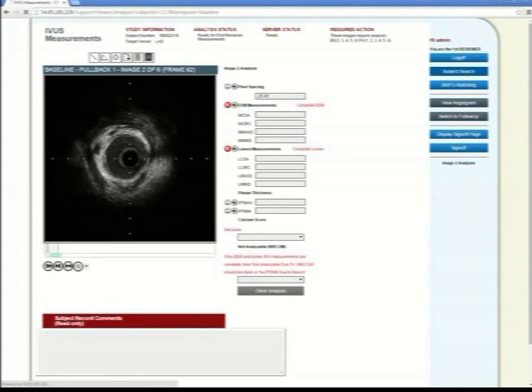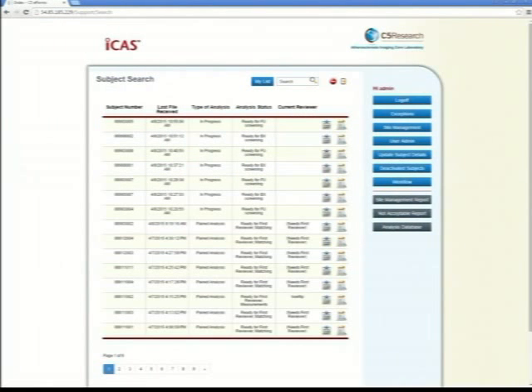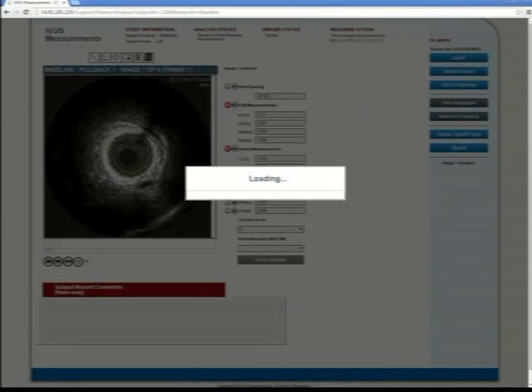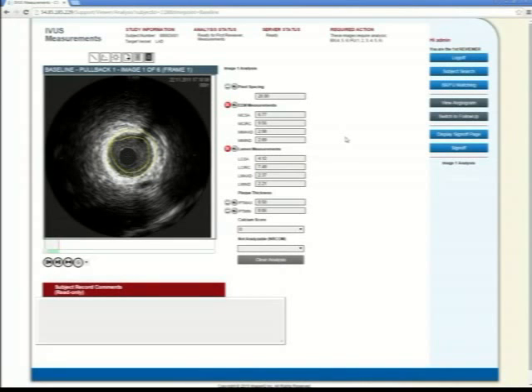And the next step, a second reviewer comes in and reviews this case. But they do not have access to the measurement tools. They are only allowed to review the images with the borders that were traced by the first reviewer. Right. And then they can annotate comments on the image. They can put arrows saying, I don't agree with the border at this place and what have you. And those, they don't mess with the values of the data. Right. It's strictly an annotation over the image.